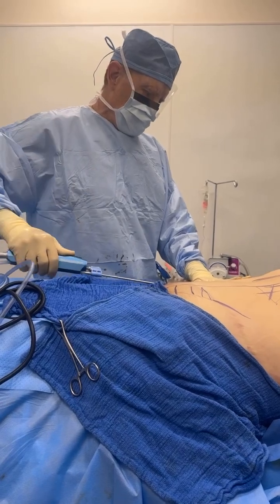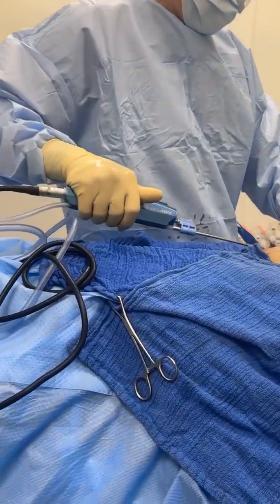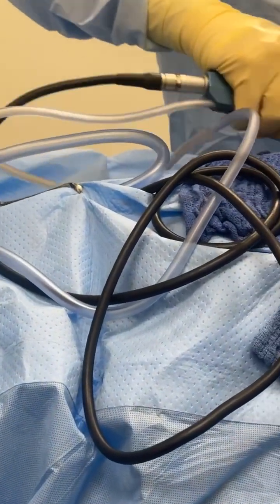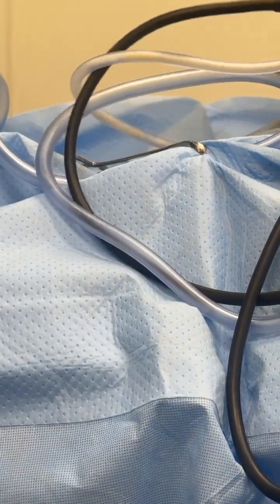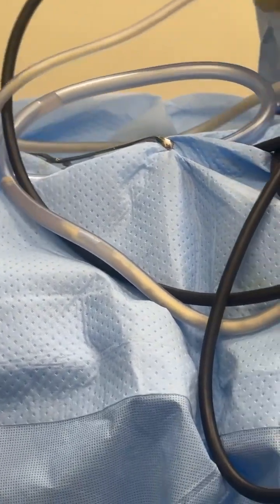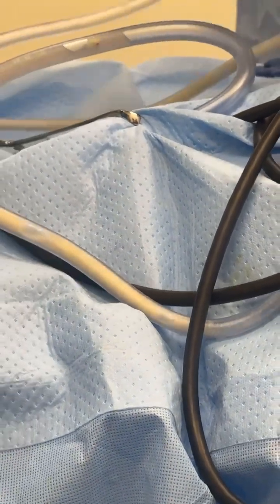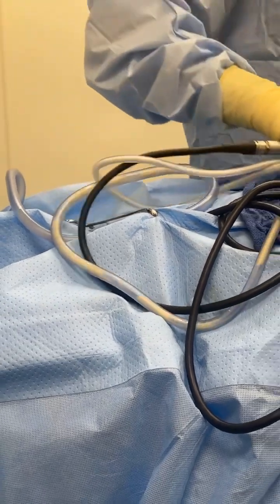So what I want you to see is what comes out of here, because whatever comes out of here is what's going to go into her bottom. So if you see bloody output, that's going to go into the bottom. If you see yellow, beautiful fat without a speck of blood, that's what's going to go into her bottom. So what do you see there? We see the yellow fat with no speck of blood.